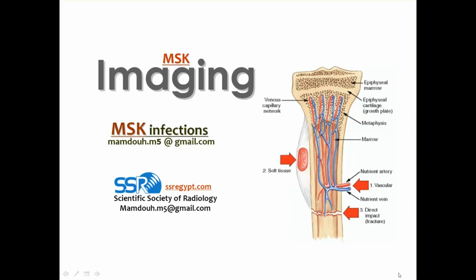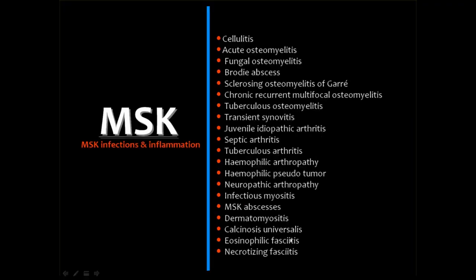Dear colleagues, now we are going to discuss a new subject in musculoskeletal imaging, which will be about the diagnosis of musculoskeletal infections. This will involve the infection of the bone, infection of the joints, as well as infection of the muscles and the related subcutaneous tissues and the fascial planes. And here are the topics that we would like to cover.